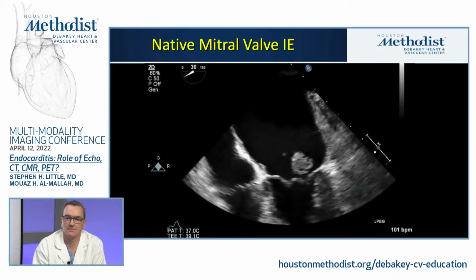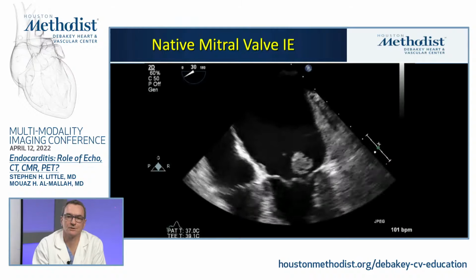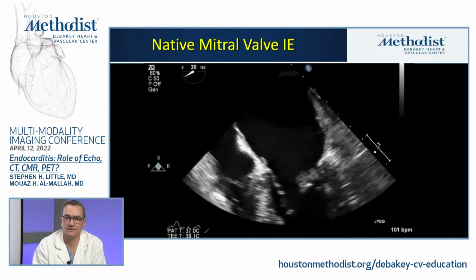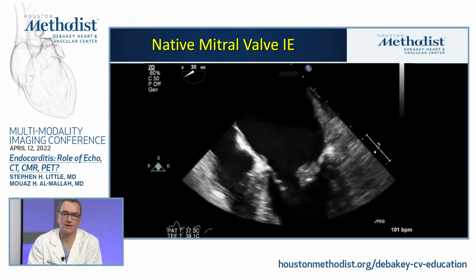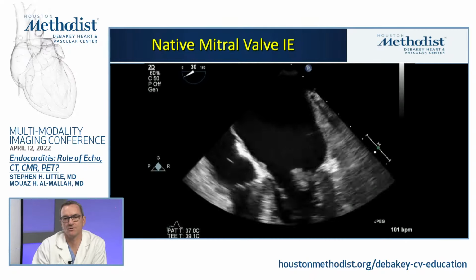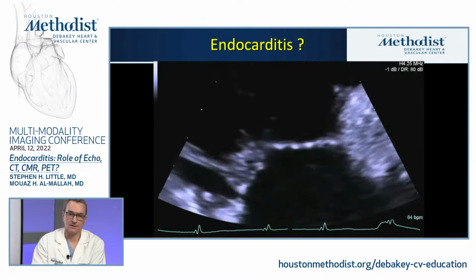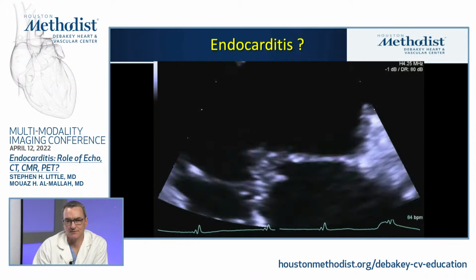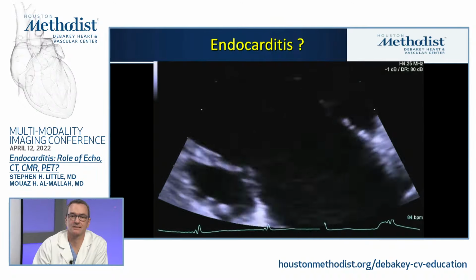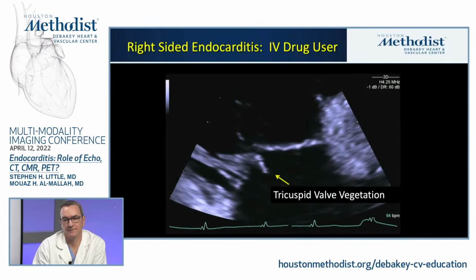But the motion of the mass can be described as oscillation. What does oscillation mean? It means that some element of the motion is independent of the cyclical motion of the valve itself. So there's valve motion, but then there's more than valve motion. So that's oscillation, and that's a very characteristic feature of most visible endocarditis lesions. This is another valve, and you see it's much smaller, it's more subtle, but it also has that sort of flickering motion that is in excess of simply the cyclical motion of the valve. So that's a tricuspid valve vegetation in an IV drug user.